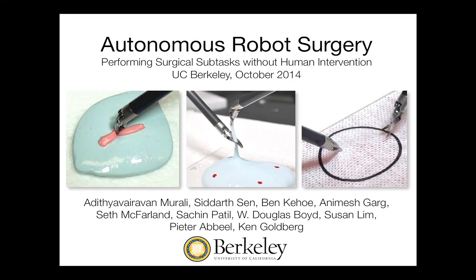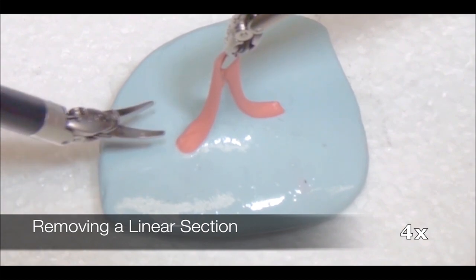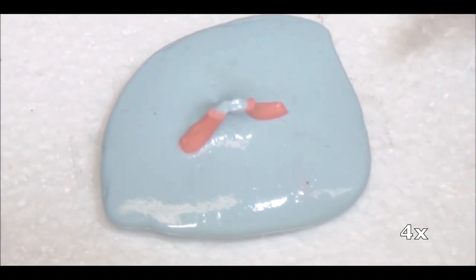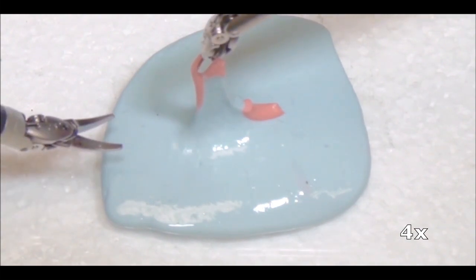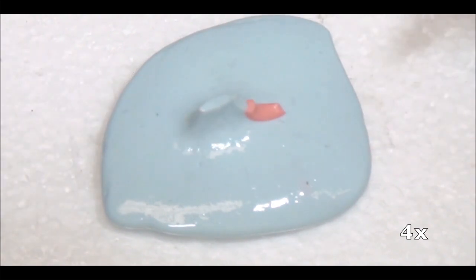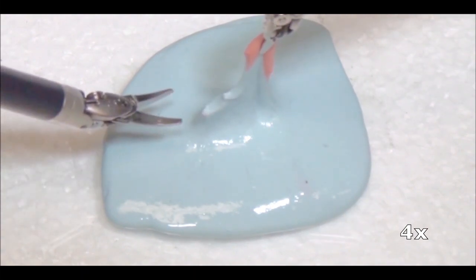We are investigating if a Da Vinci surgical robot can autonomously perform tedious subtasks. This video demonstrates new results involving cutting and deformable tissues using a learning by observation approach described in detail in the paper. The first subtask is linear debridement, removing a linear section of cancerous tissue. We use plastic putty as tissue phantom. A computer vision system identifies the linear section and guides the robot to extract it in subsections. In 5 trials, the robot successfully extracted all target tissue in pink.